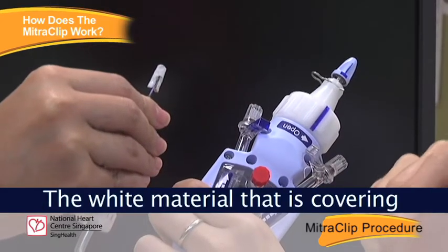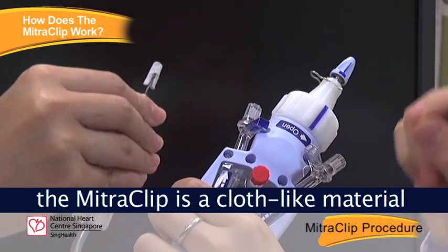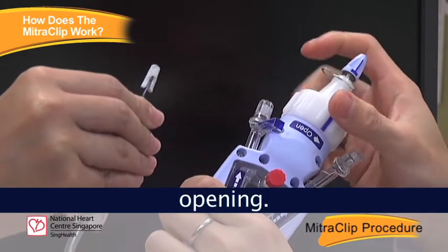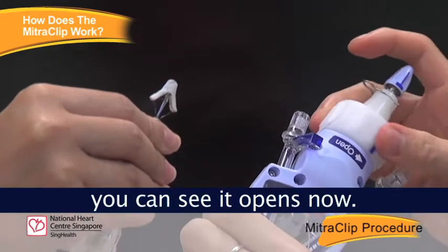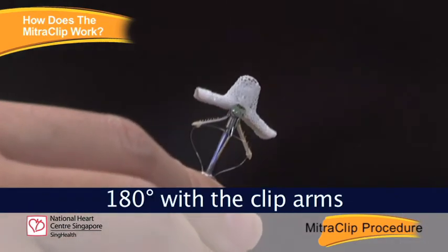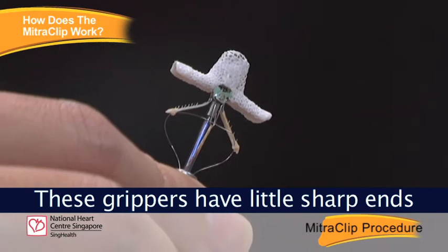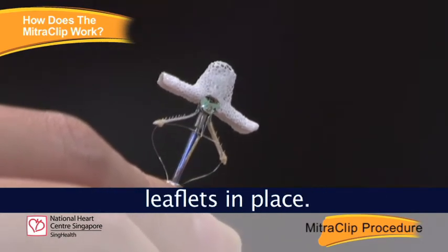Here you see the mitral clip. The white material covering the mitral clip is a cloth-like material that is meant to promote healing. I am going to open the mitral clip now and you should see the clip arms opening. As I undo the clip arms, you can see it opens to about 180 degrees. Below the clip arms you will see the grippers, which have little sharp ends to help grip the mitral valve leaflets in place.